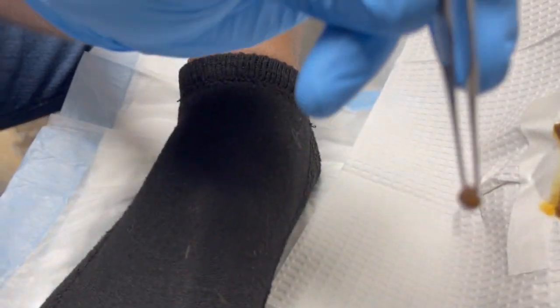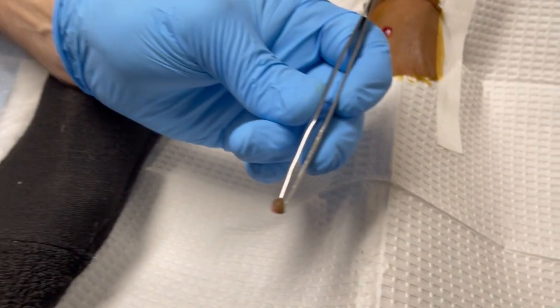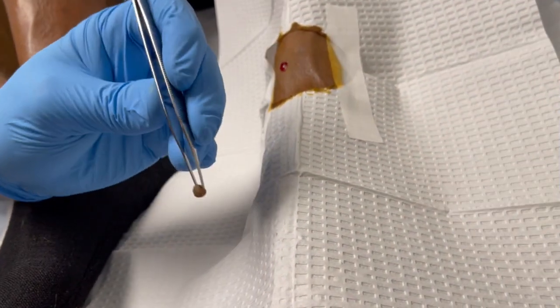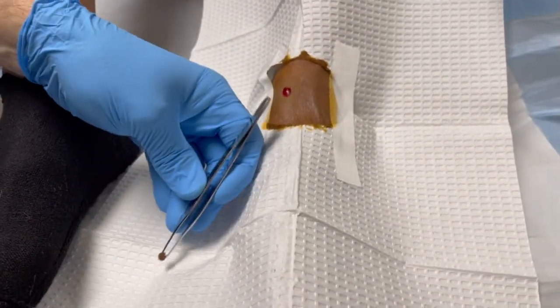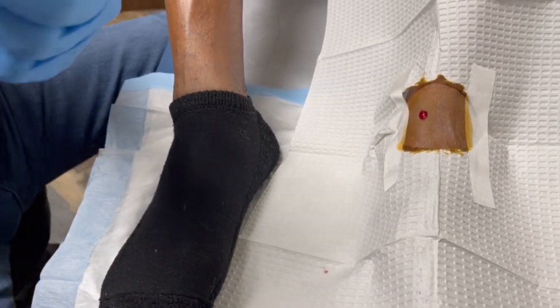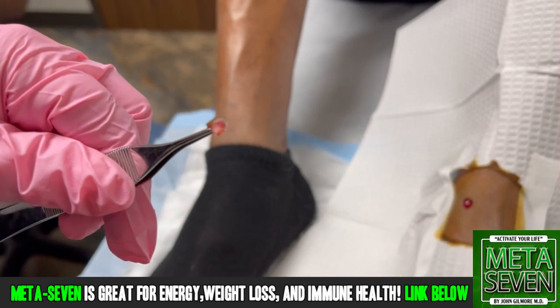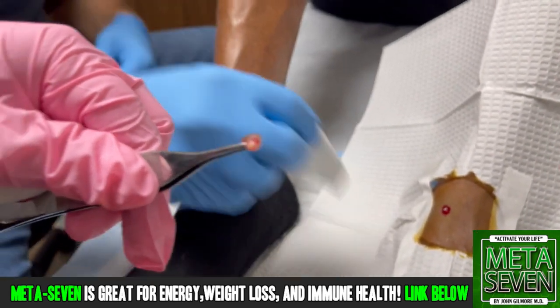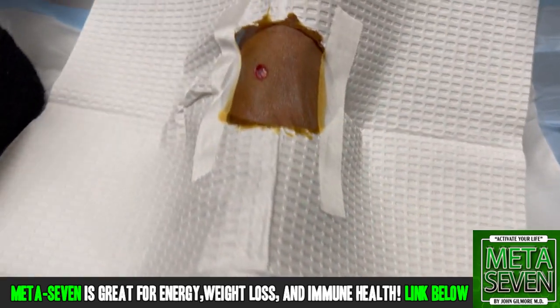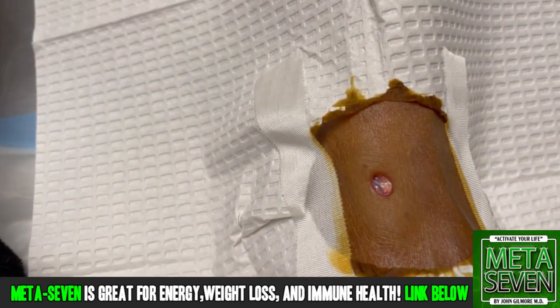You want to get a close-up of that? It always looks like I'm shaking all over the place, but I can just set it right there. There we go. Now you got a hole in your foot — that's what you get. You come in here and complain about stuff like this, you end up with a hole in your foot.